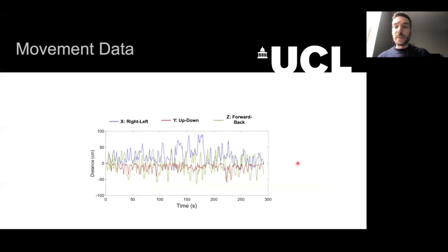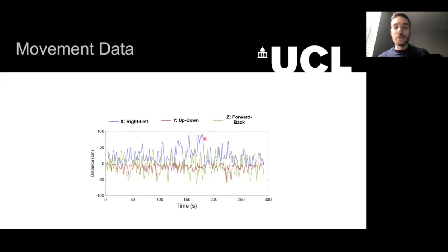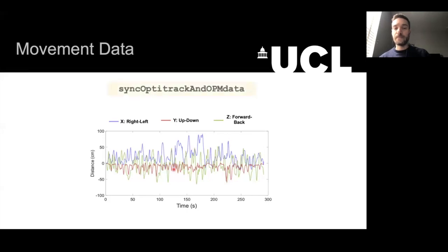Here we're plotting the movement data analysed from the OptiTrack recorder. The y-axis is the distance from the start position and the x-axis is time. The range of movements is extremely large — up to 100 centimetres — which is a hundred times larger than a movement you could make in a conventional cryogenic MEG system. The movement is also continuous throughout, not just a one-time head shift. We can sync this information with the OPM data using the function sync OptiTrack and OPM data.